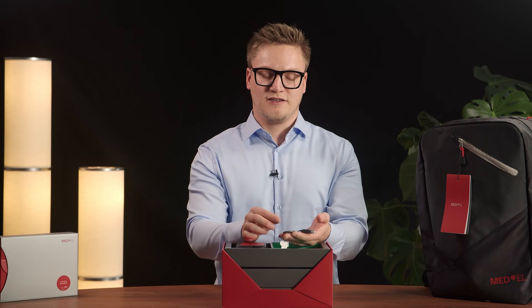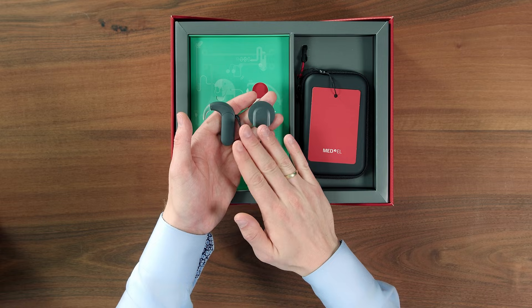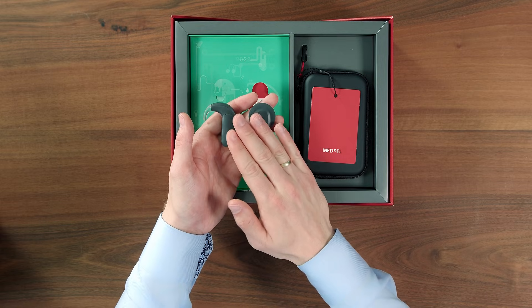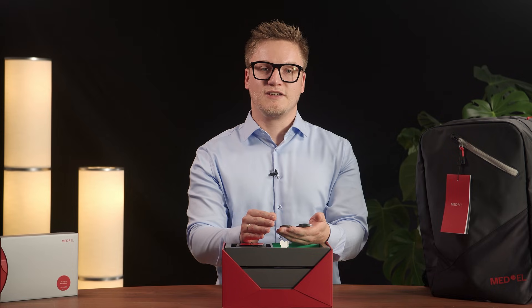And there are a few things you cannot see just looking at it. Sonnet 3 is waterproof and equipped with built-in streaming. That means you can dance in the rain while streaming your favorite song directly to Sonnet 3 without an additional device.